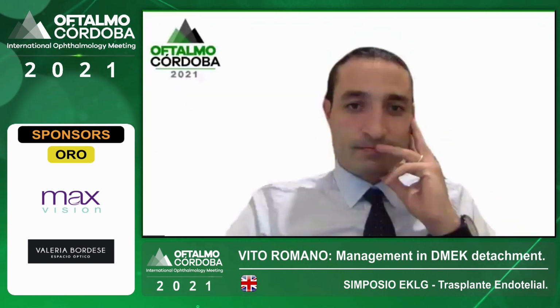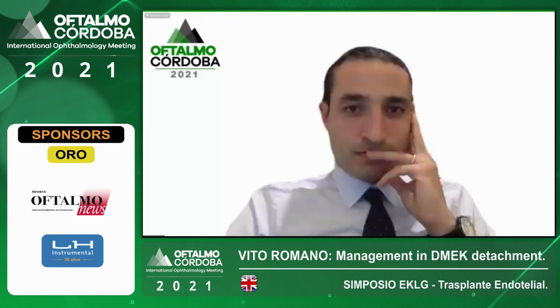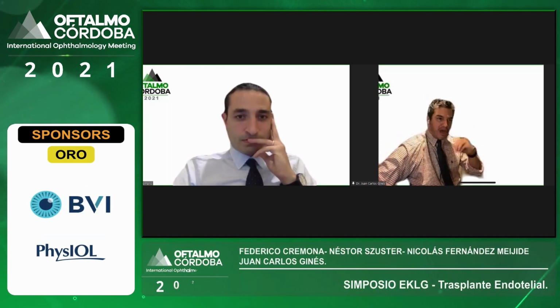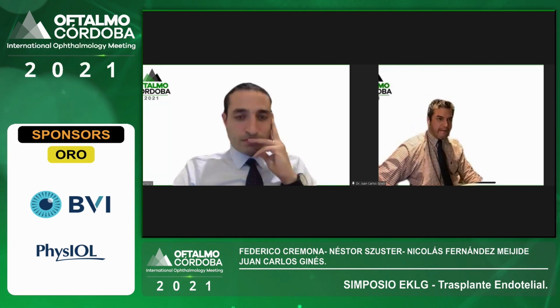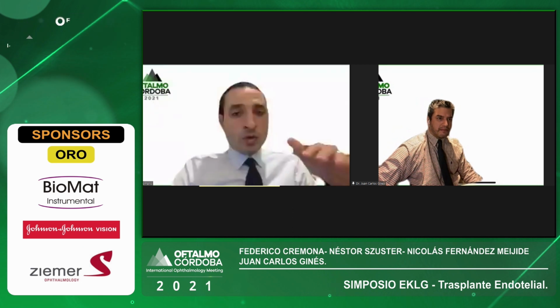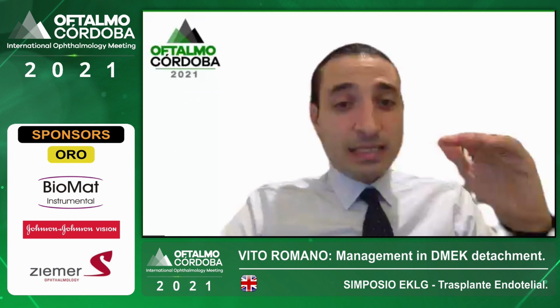Vito, one last question. Would you agree that, the same as DSO and DMEK, in my experience at least, when you strip but not scrub the endothelium, the results are always better? Yes, I think you're right. The smoother the landing zone of the graft is, the better it is.